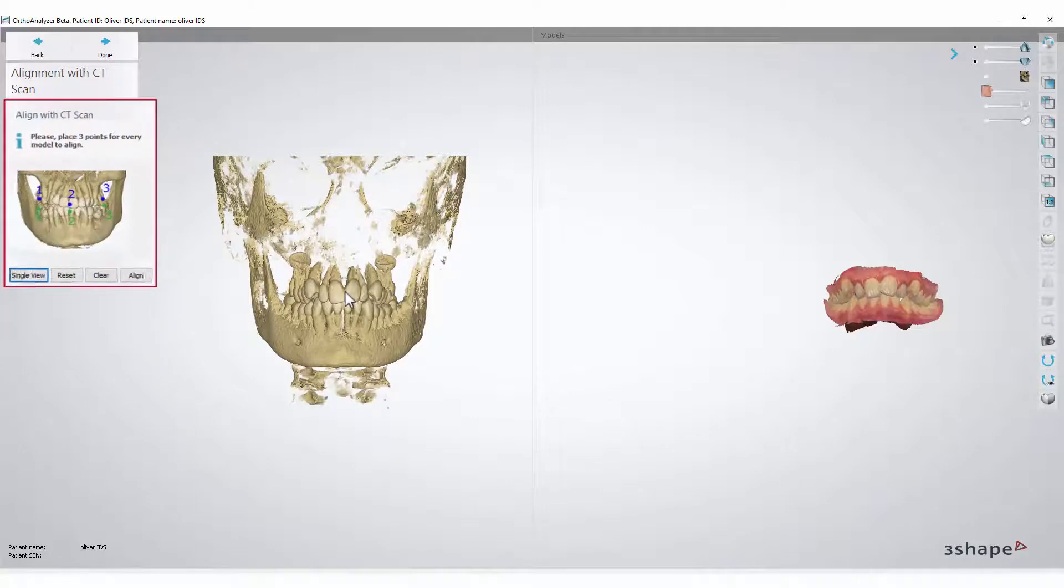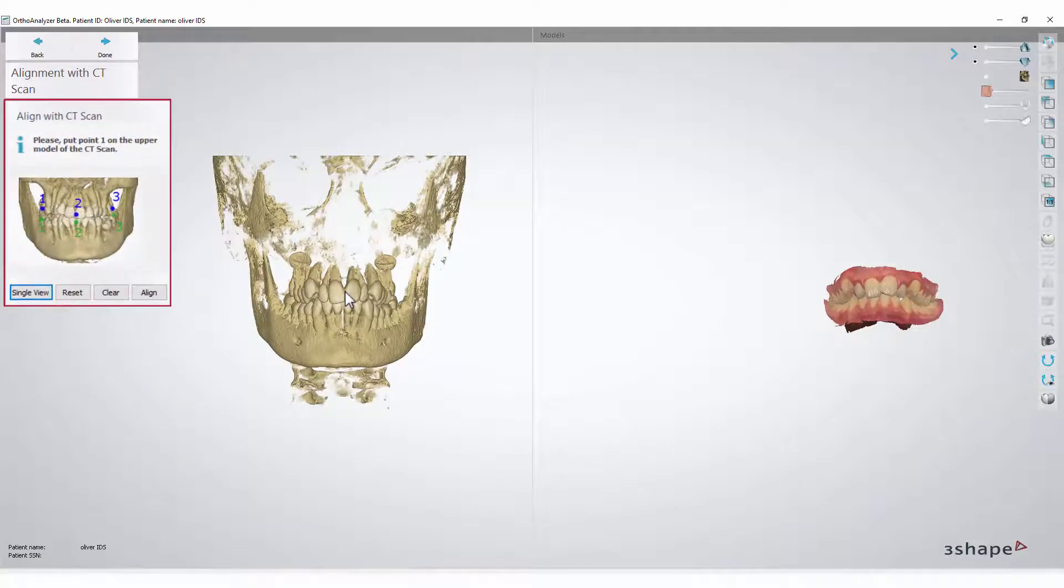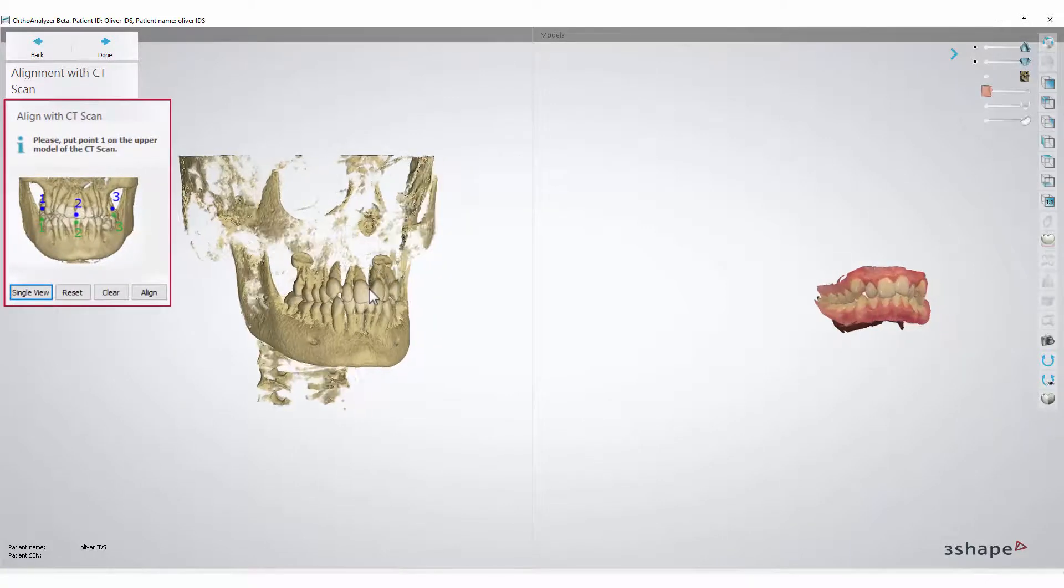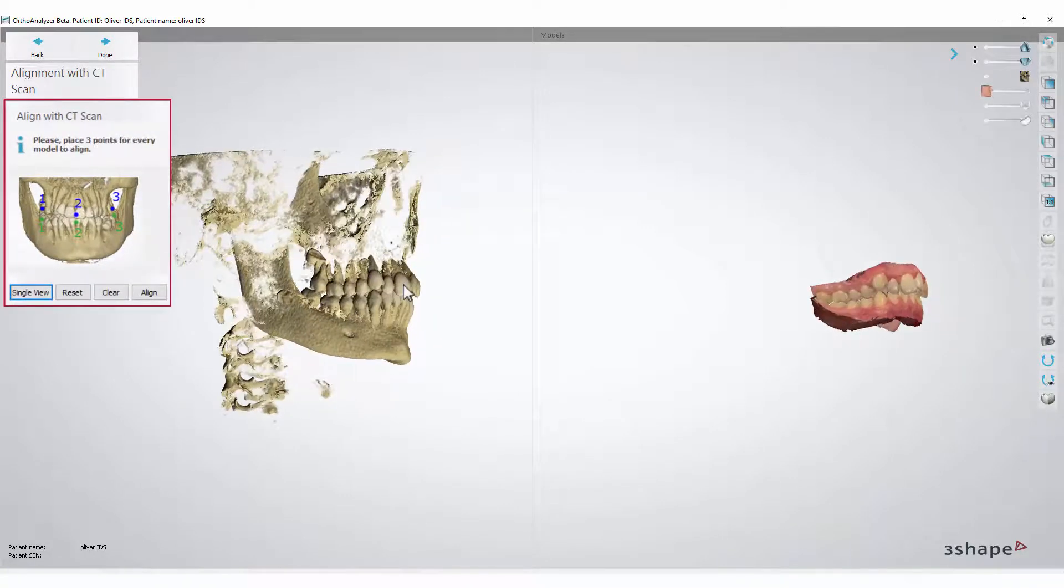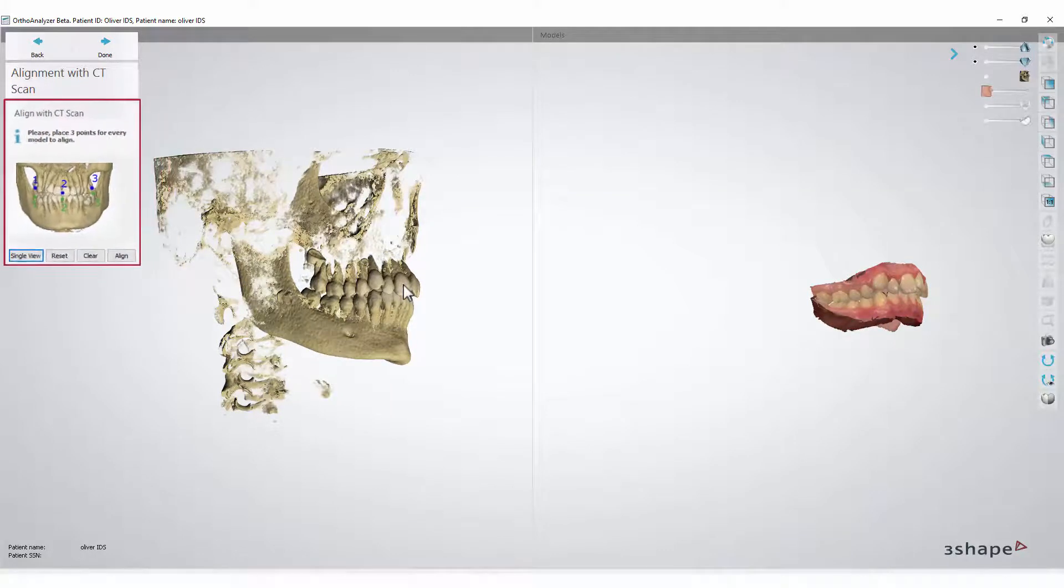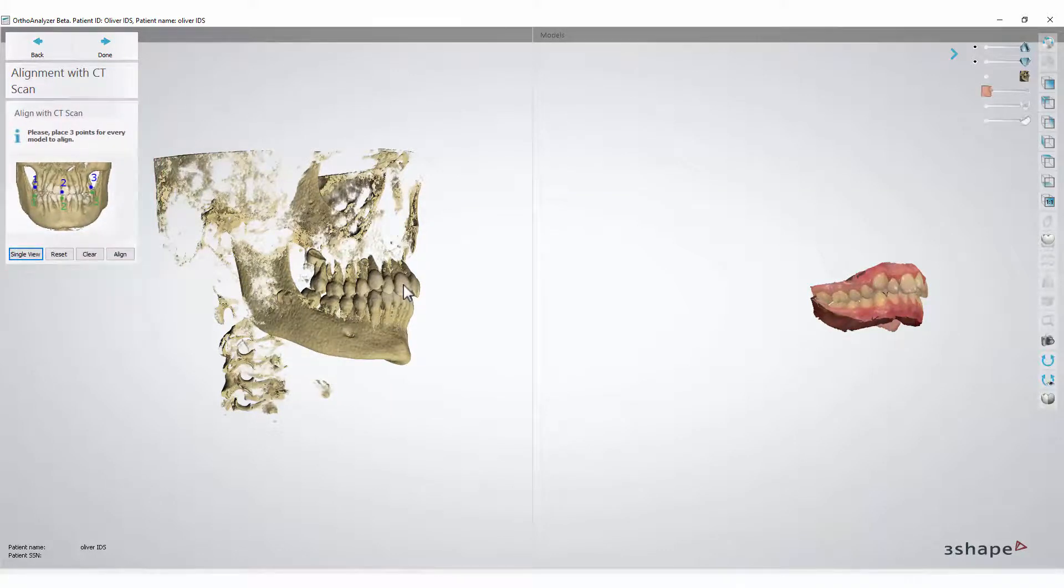Now, you must place three points in the upper jaw and three in the lower jaw, on both sides. For the proper alignment, they must be placed in the same location and on the same tooth.